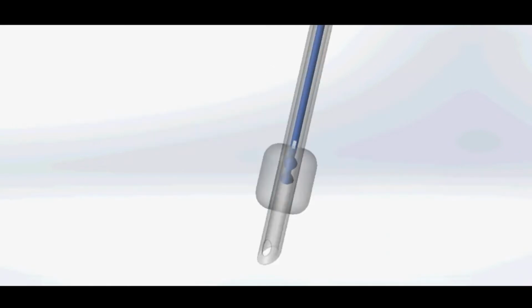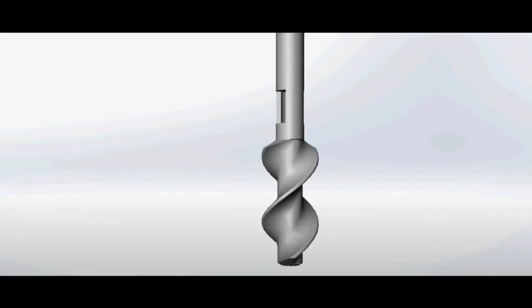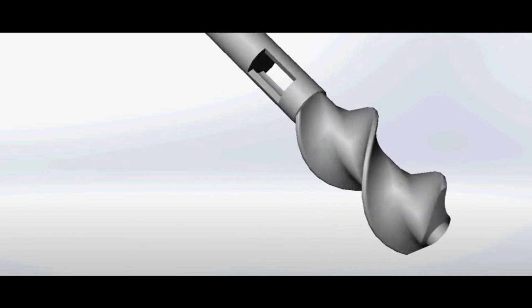The rotational motion of the tip will not exert forces outward onto the endotracheal tube and prevent soft tissue damage and ulceration of the trachea. The center of the tip is ported to allow for airflow from the ventilator to flow through the catheter, out the tip, and into the lungs. The catheter also acts as a drive shaft, translating rotational motion of the motor into the tip.